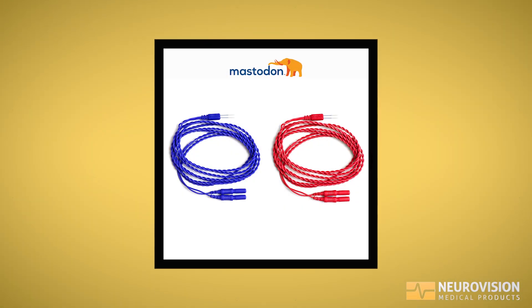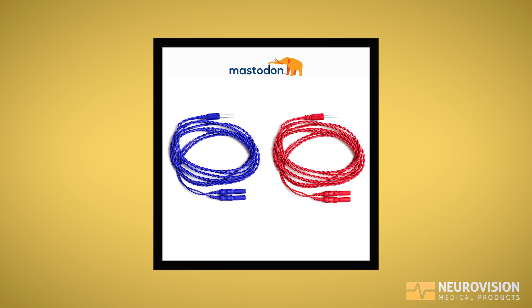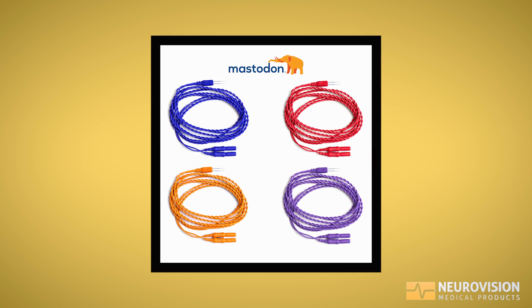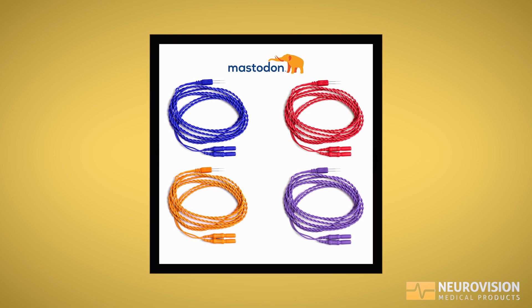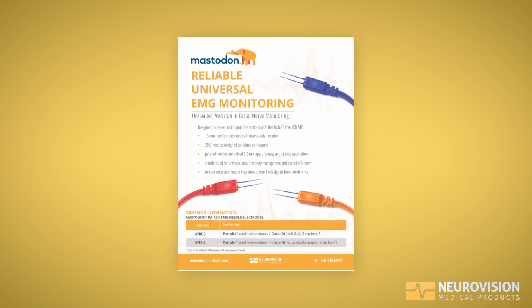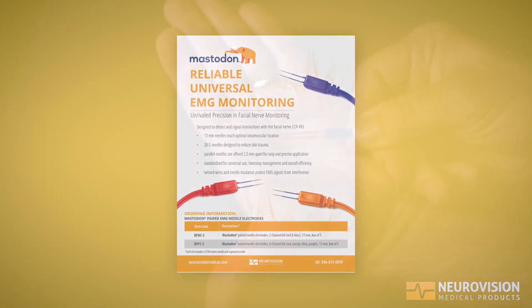Mastodon needles are available in a two-channel kit, comprised of a blue and a red needle set. They can also be had in a four-channel kit, which would add a purple and orange needle set. The needles themselves are 13 millimeters long and they come together in a hub approximately two and a half millimeters apart.